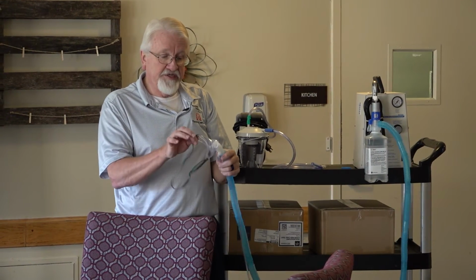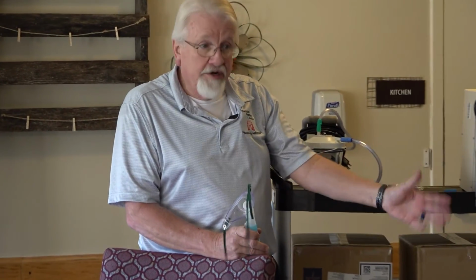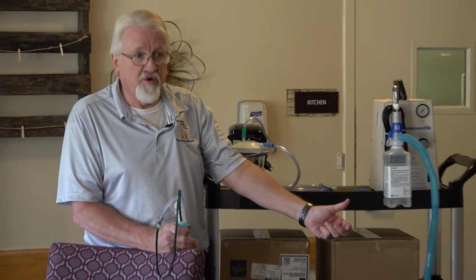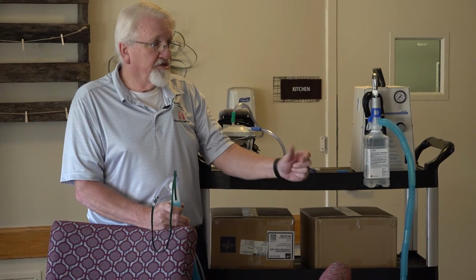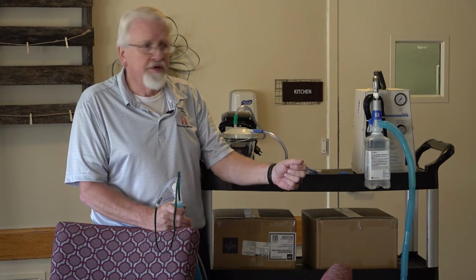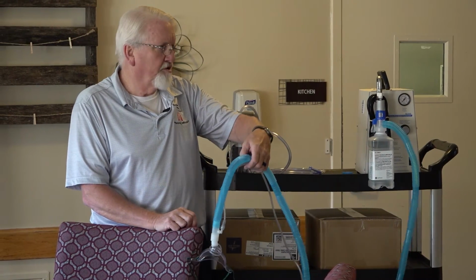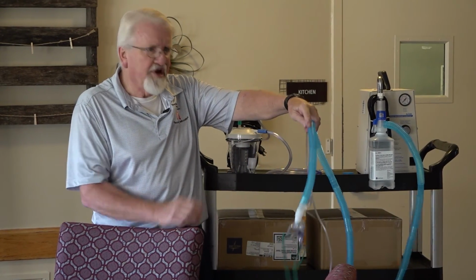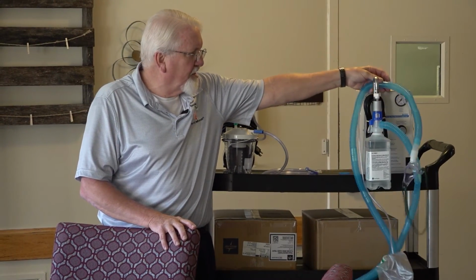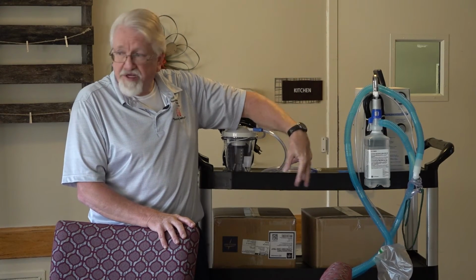Okay, and the next is going to be the trach collar. Your concentrator is going to be on whatever flow or FiO2 that the physician's order is for. Again, sometimes at night you may have to crank them up 1 liter or something. Just depends. Until you get used to the patient, monitor them on a regular basis until you find out how they're going to respond to oxygen and this humidity both during the day or at night. Any questions about this setup?